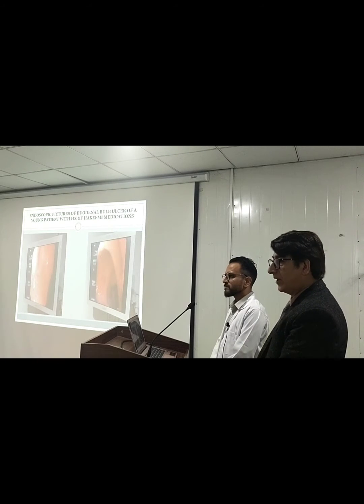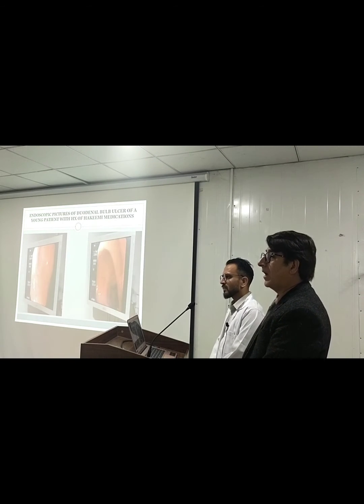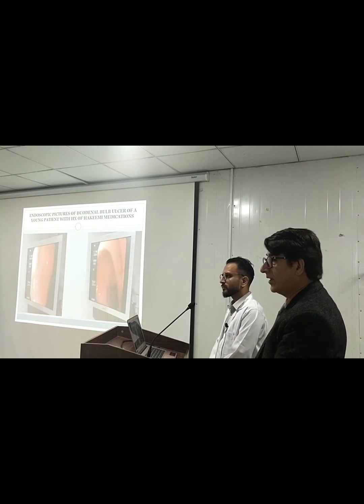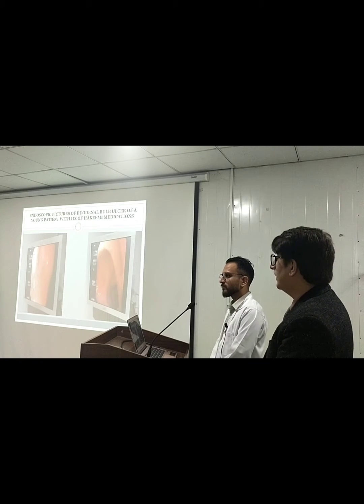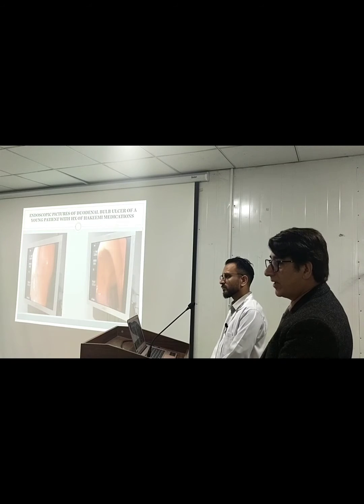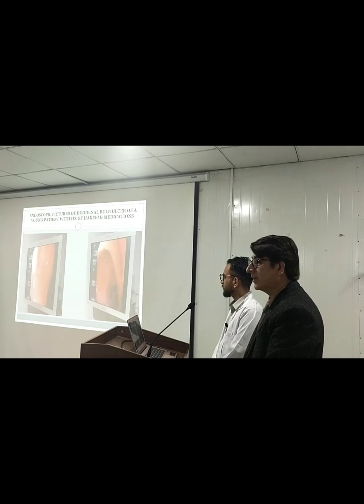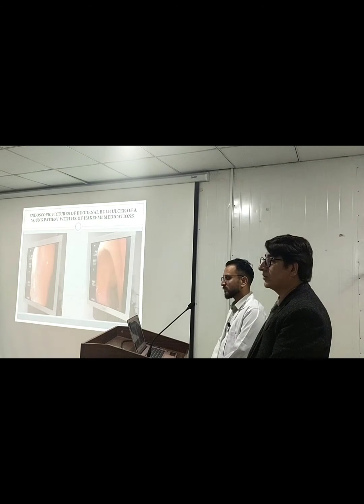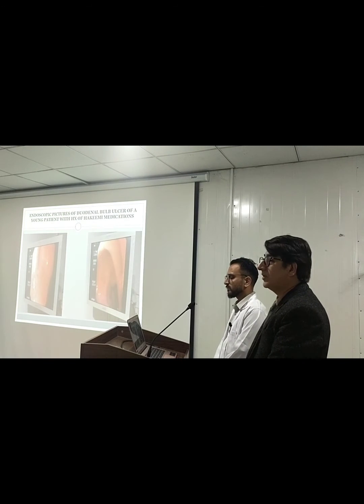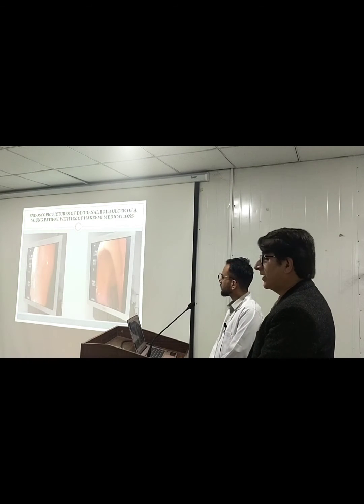Usually we do the biopsy of gastric ulcers, considering the age of the patient and comorbids. If the patient is older, having an index bleed and associated weight loss, we usually do the biopsy. But the recommendation is to do the biopsy of every gastric ulcer. But sometimes, if we have a clear indication and clear cause, like NSAID induced, or a patient having a history of ischemic heart disease who has taken antiplatelets and has the bleed, we usually avoid taking biopsies because we have a clear reason and a clear picture of the ulcers.